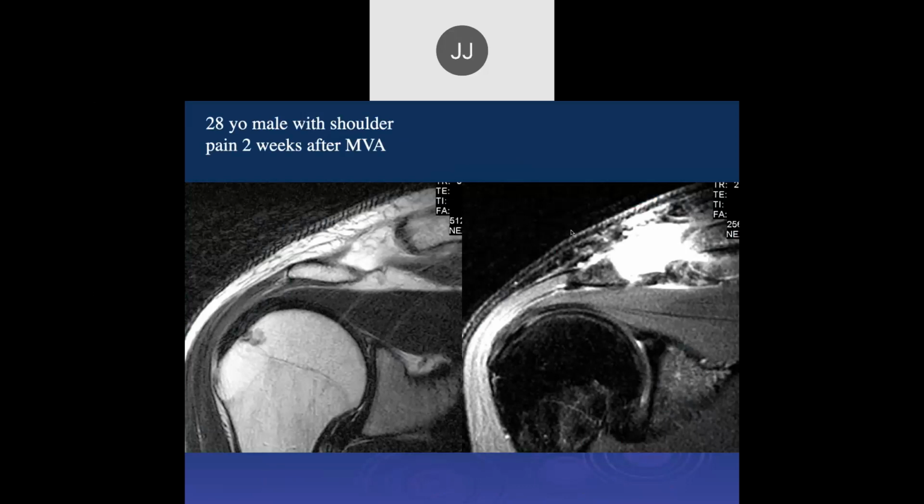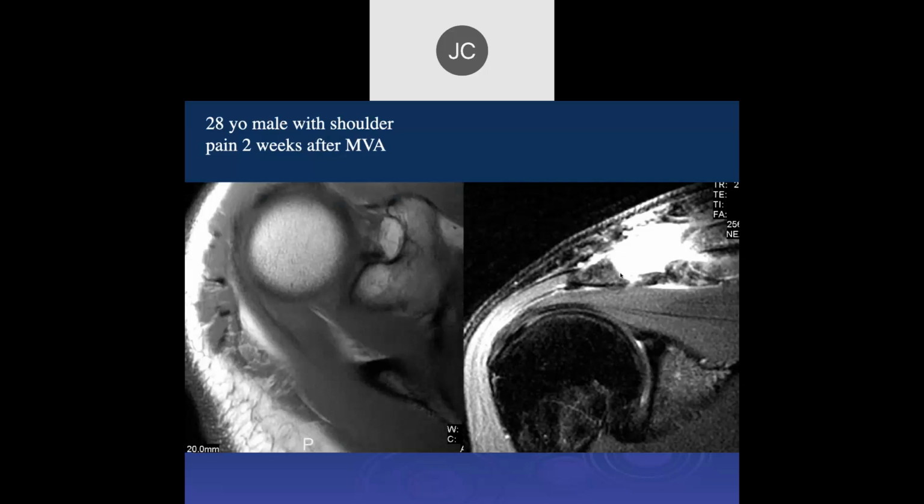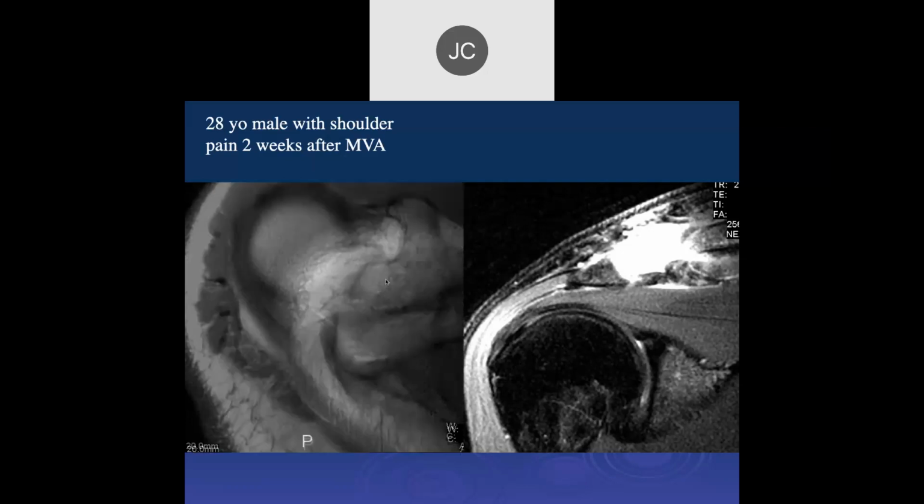Okay, 28-year-old male, 2 weeks after MVA. We see widening of the AC joint. Lots of edema there. And on the axial on the left, here's one image. In this image, this is the top of the glenoid, and that's the coracoid process there. Now let's do one image above that, and this is what we see.